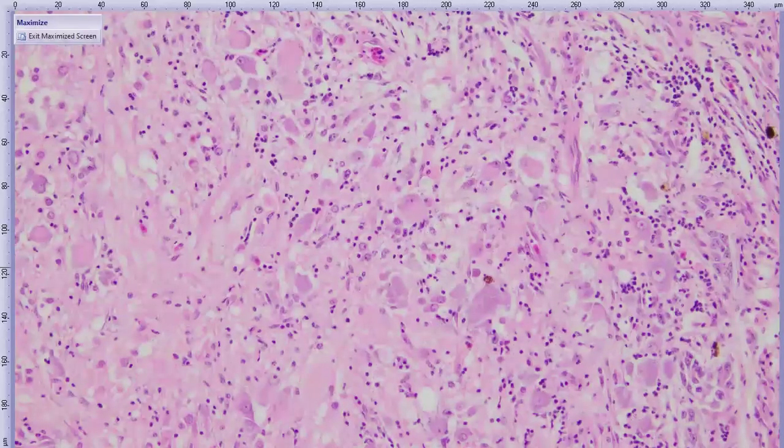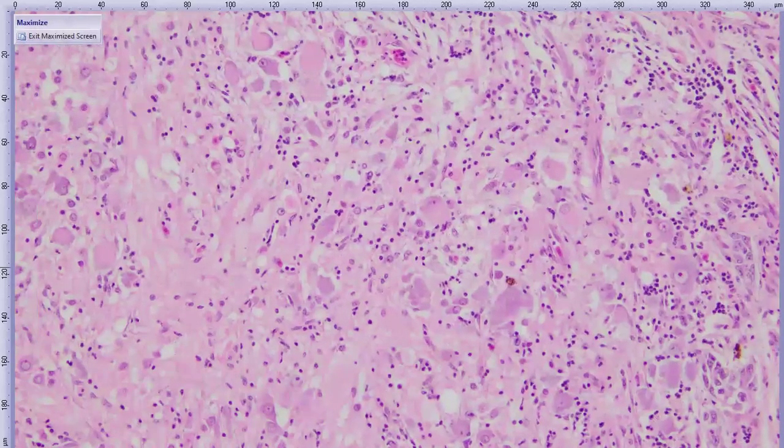So there's this area that the tumor kind of blends into, and we can see these guys, which are looking like ganglion cells or neurons, and we can see all these little tiny nuclei, which are looking like glial cells. So here's more kind of ganglion cells. So this is really disorganized neural glial tissue. And at least in terms of how expansive this is and how disorganized it is, we wouldn't expect to see something like this normally at this site in the eye. So this is part of the tumor.